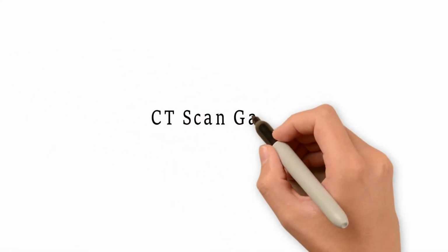This is the CT scan gallery. The CT scan revolutionized how we looked at the brain. Now, we can see through the skull at the tissues inside. Not only can we see the inside, but we also have the option to make 3D renderings of the scans.